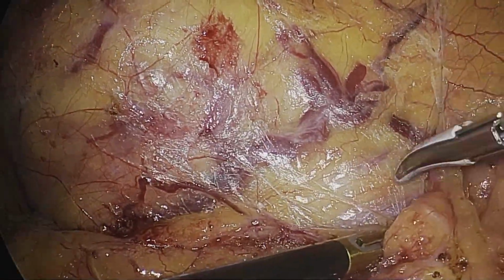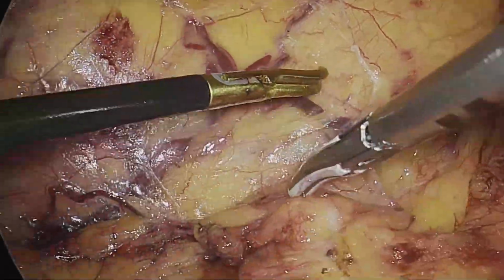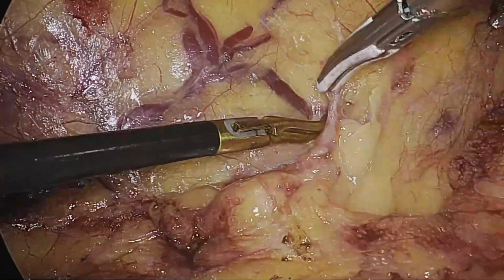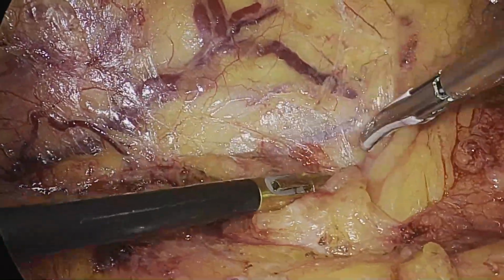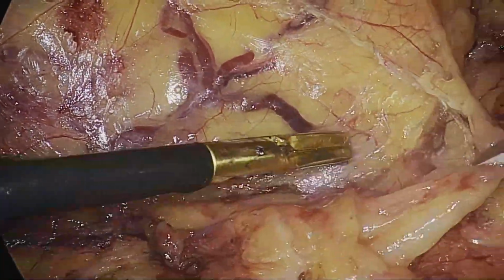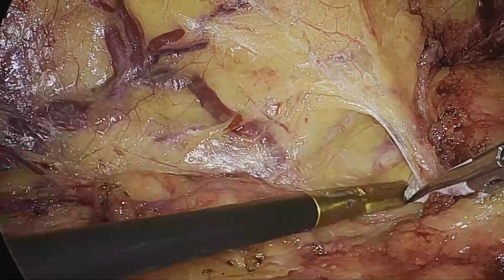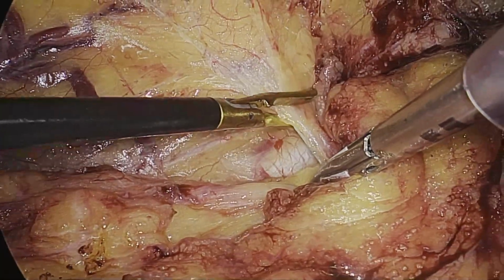Here in this frame, we can see the neovascularization that comes with the renal masses. They are particularly vascular, with various growth factors and angiogenesis in these tumors. One should be very careful to dissect away from these neovascular areas.